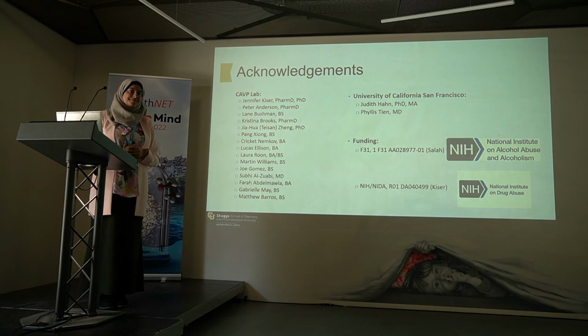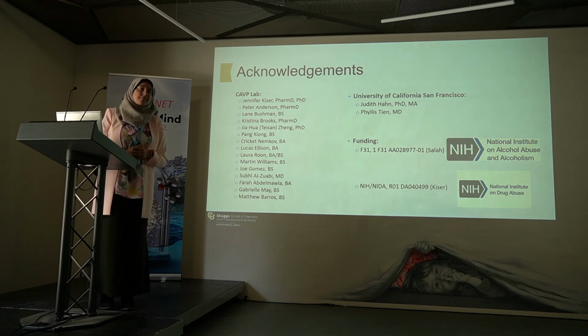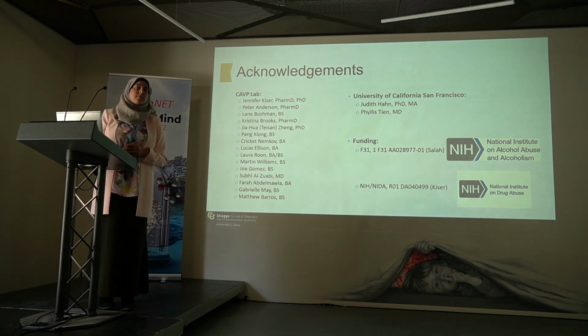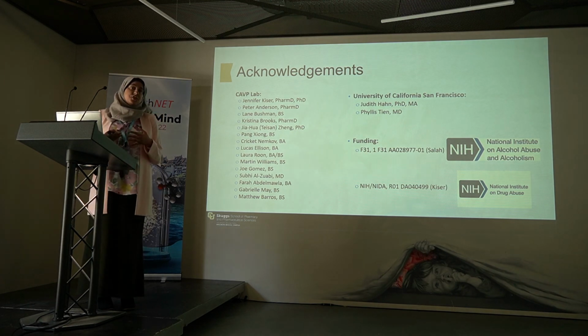Thank you. Indeed, nicely showing the importance of interlaboratory comparisons. In your methods, did you evaluate whether the dried blood spot concentrations are the same as if you would measure them in liquid blood? Because we find that that's something which is very important to do as well, that the dry blood gives the same result as the liquid blood. Yeah, I agree that that's a very important study. We do not have a method to quantify PEth in whole blood, so that's not a comparison that we've done, but that would definitely be something interesting to look at, if those quantifications would be the same. Okay, thank you.